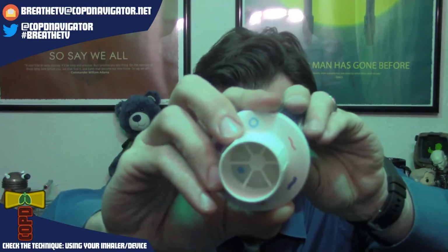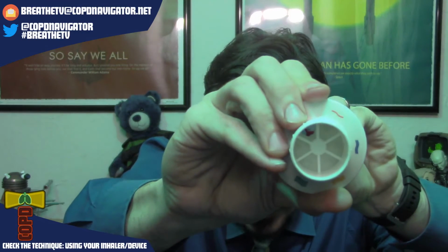Basically what it is, it's a meter that can sense your inspiratory flow, how much flow you're generating to get that powder out. And what makes it a dial is that, you should be able to see it on here. There we go. As I rotate it, you can see the little orifice in there getting larger and smaller as we move it around, because this device is able to simulate the resistance of the different inhalers that are on the market. And using this, we're able to set it to a particular range based on your type of inhaler, and figure out if you're able to generate enough inspiratory flow.